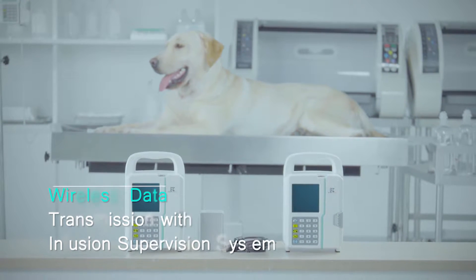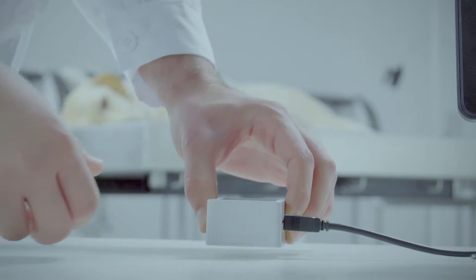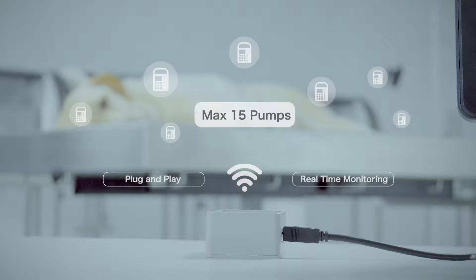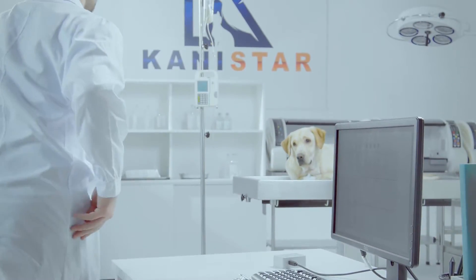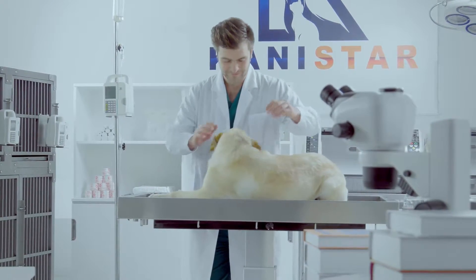Wireless data transmission with Infusion Supervision System. This system allows you to monitor the operational status of as many as 15 pumps per receiver at once. This simple plug-and-play Wi-Fi receiver system can be supervised on the hospital management computer.